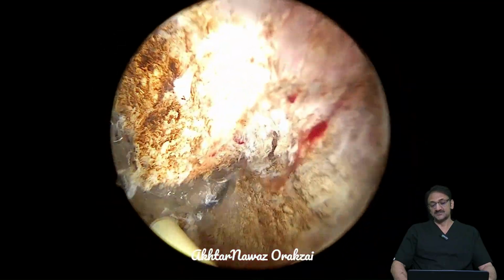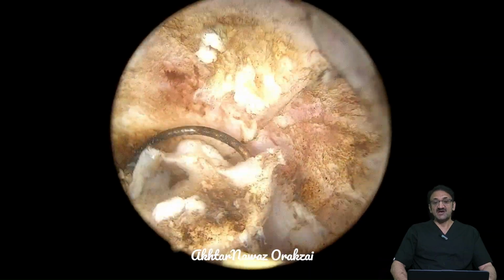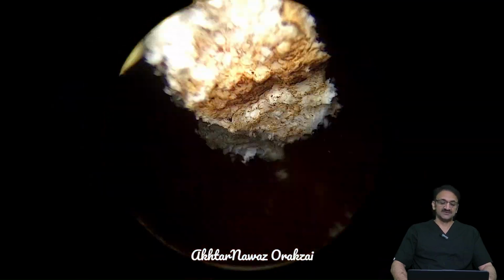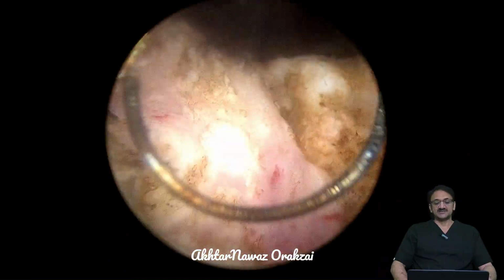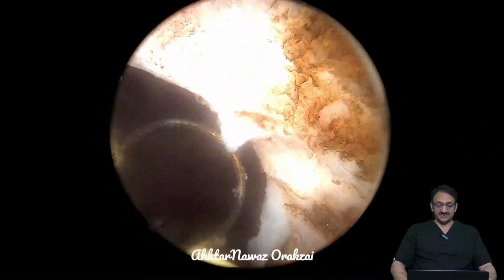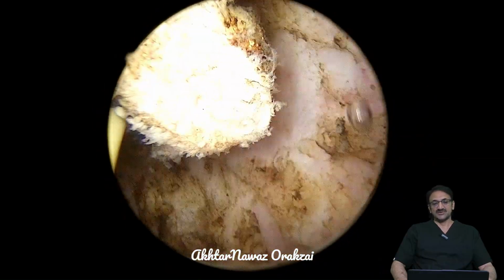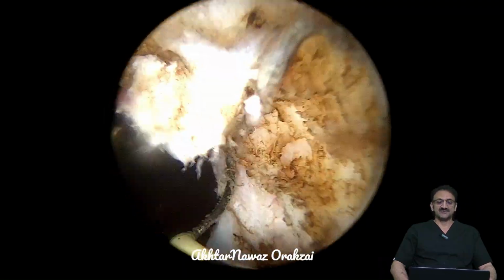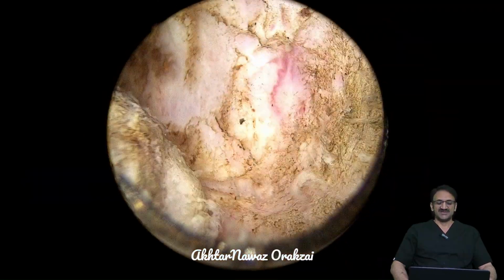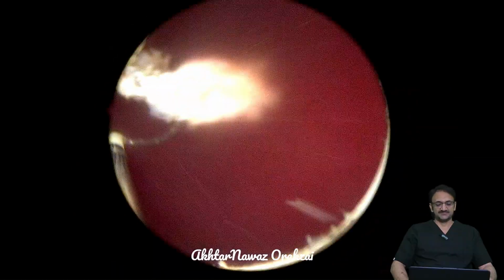So those episodes of retention may have been due to the stones coming into the urethra. Anyways, he needed a wide prostatic urethra, so that if these small stones come, he will be able to pass them per urethra. His age is around 62, but he is a physically very fit patient.